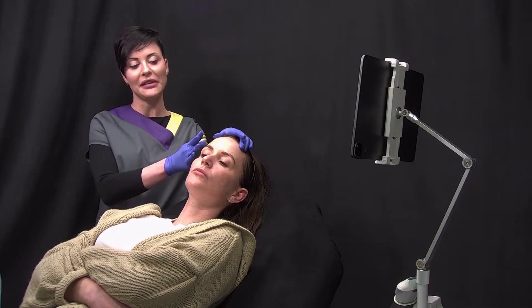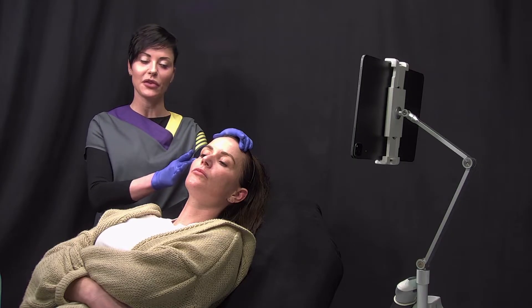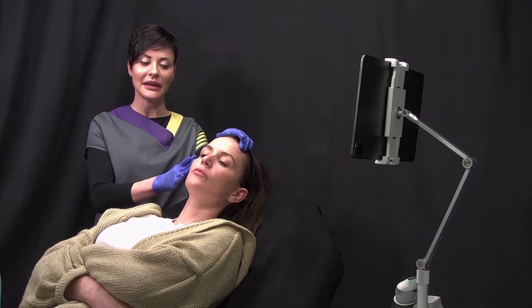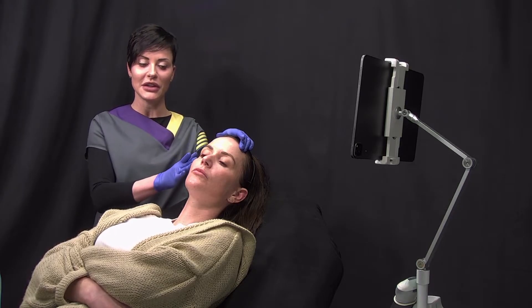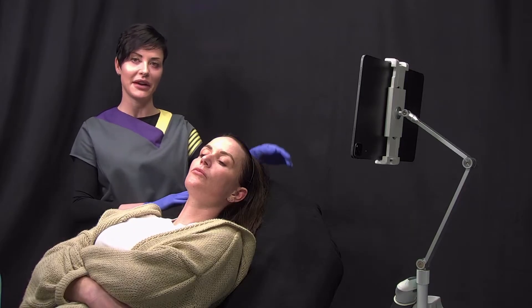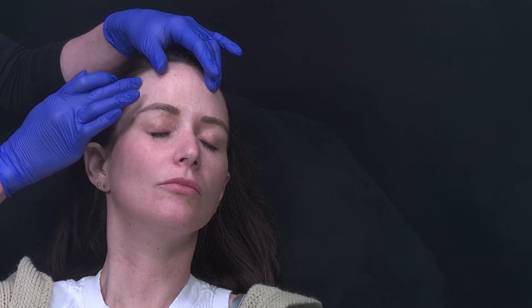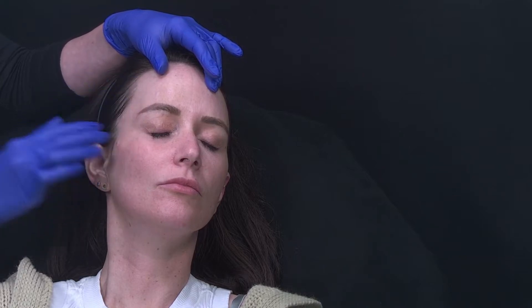Our patient has presented with temporal volume loss and we're going to be improving the contour of the upper face down to the cheek, blending the result into the cheek so that we can improve this concavity at the temple area. To achieve an even volume restoration of the whole temple right up to the temporal crest, I will be using the interfascial technique.